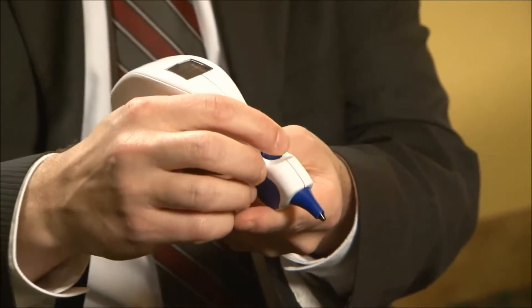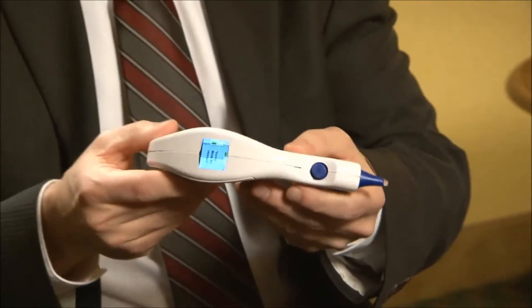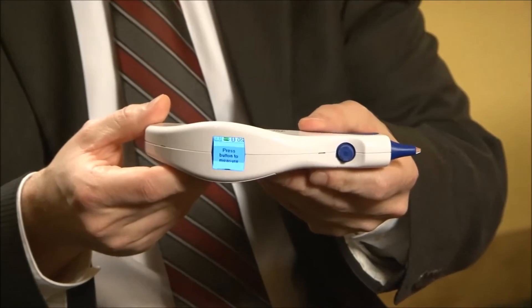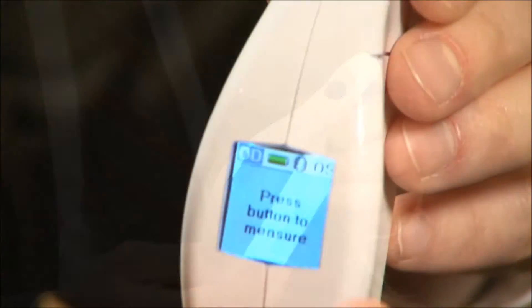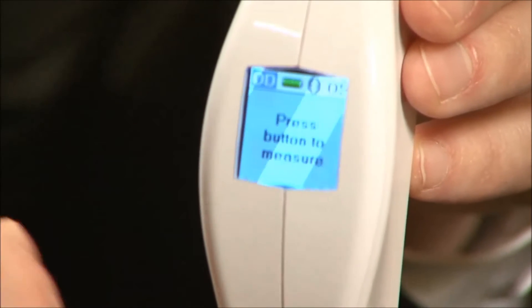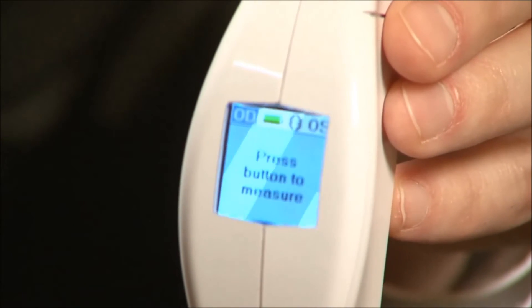To turn the instrument on, all you do is tap that button once. The screen shows you the status of the battery, and then it tells you to press the button to measure. The screen is very simple and provides guidance on how to use the instrument. Right now it says: press button to measure.